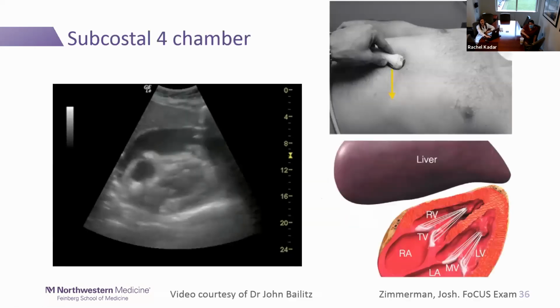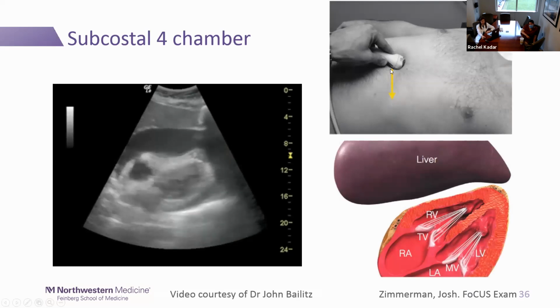But then I go to get my ultrasound. And this is a subcostal 4-chamber view. So your probe is down here below the xiphoid process, indicator towards the patient's left, with ultrasound beam looking up at the heart from below.